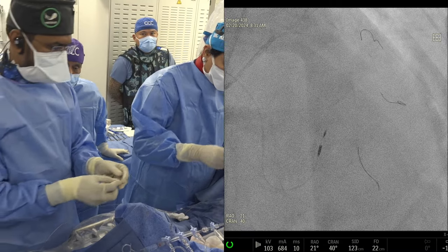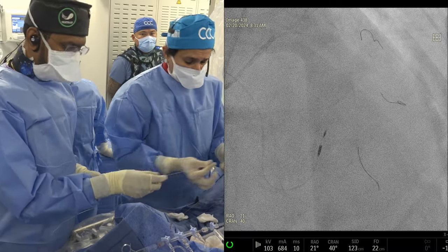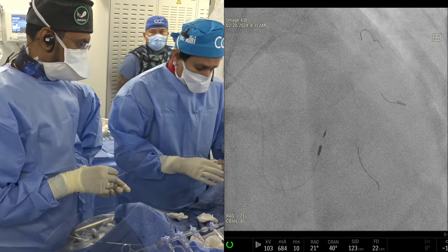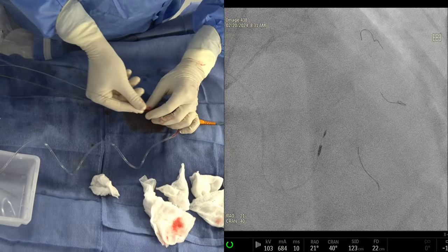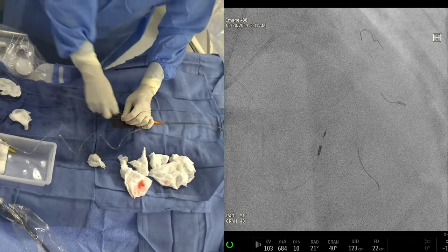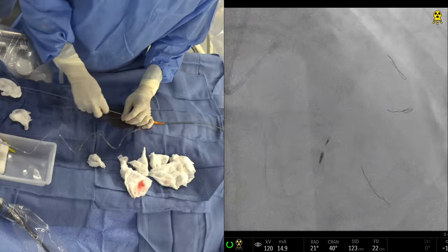Now, I still have to see the randomized trial showing that two drug-eluting stents versus one side branch with a drug-coated balloon in a large vessel was better. And if anybody wants to put it in the chat, the answer will be zero. There has been no trial of a large vessel side branch comparing two DES versus one DES and one drug-coated balloon. There are small studies, small vessels, some registry data, but no randomized trial.